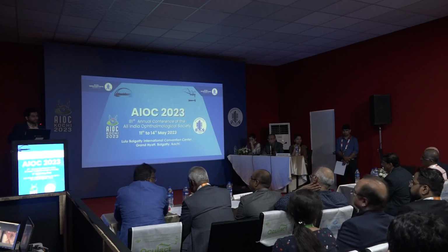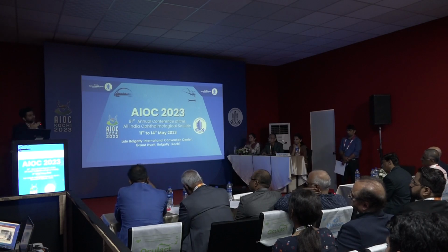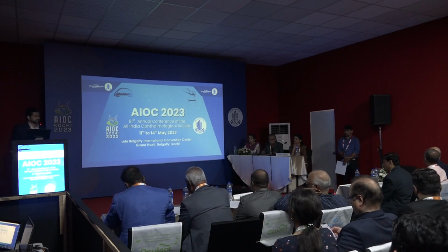Yes, sir. The thing is, we don't direct the stab entry into the eye. We direct it slightly away, parallel or maybe even opposite to the direction of the eye. And in which quadrant do you make this stab? Inferonasal quadrant. It's always in the inferonasal.